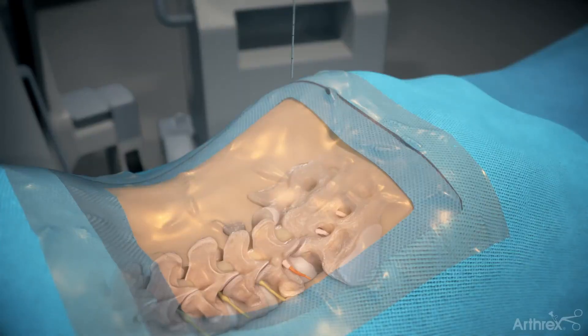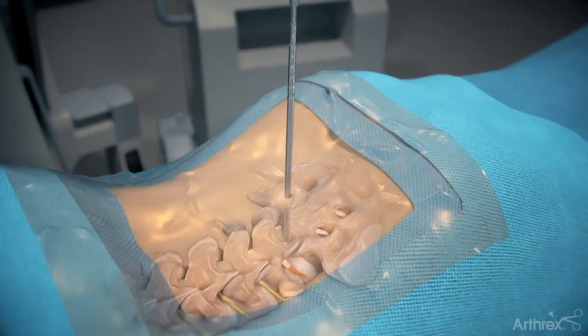Insert an introducer needle. Remove the stylet and pass a guide wire through the cannula, then remove the cannula. Insert serial dilators over the guide wire until the appropriate diameter is achieved. Continue utilizing dilators for steps 2 and 3.